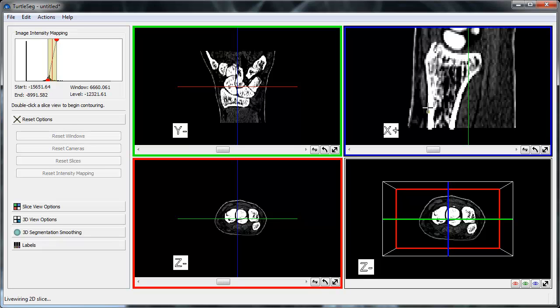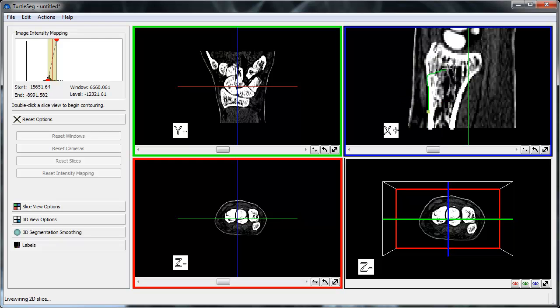We begin contouring by double left-clicking on the object's boundary. TurtleSeg uses LiveWire to speed up the task of delineating a 2D object, so as we move the mouse, the LiveWire will automatically snap to edges of objects.